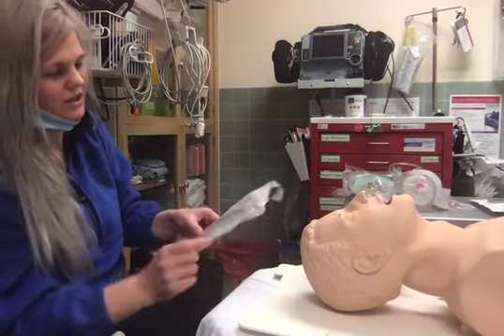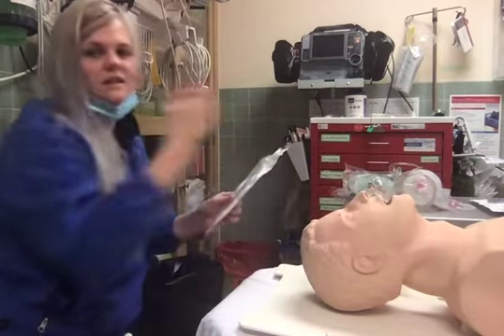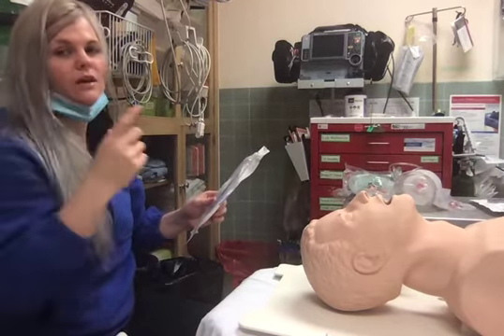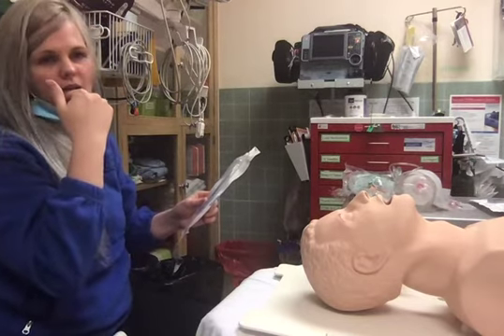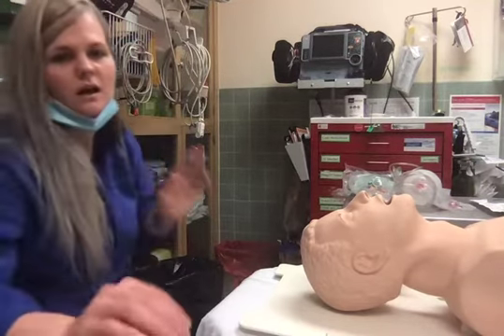You take the bevel edge and put it on the inside of the naris. So you're going to put bevel side in, twist it in, and it's just going to follow that track back to the back of the throat and then down. It'll sit not past where your gag reflex is initiated.